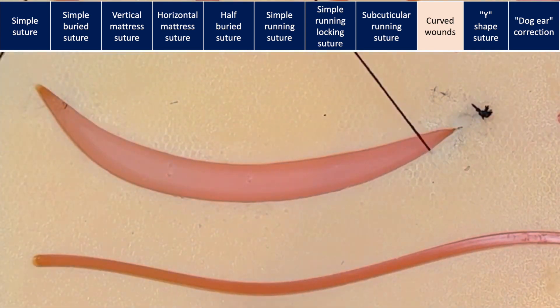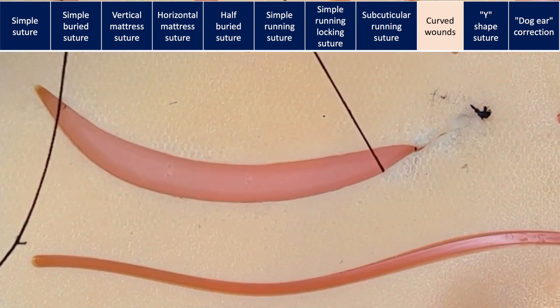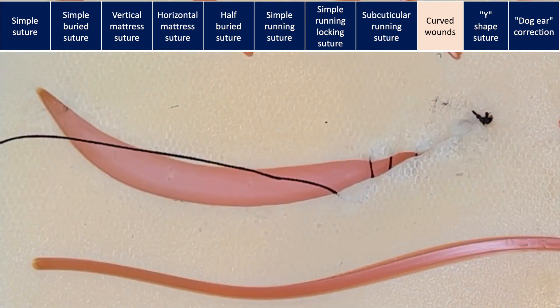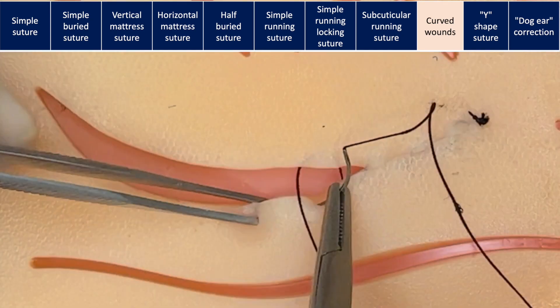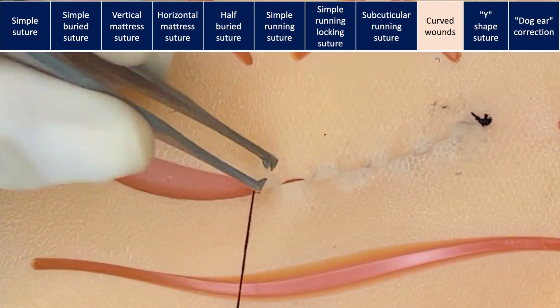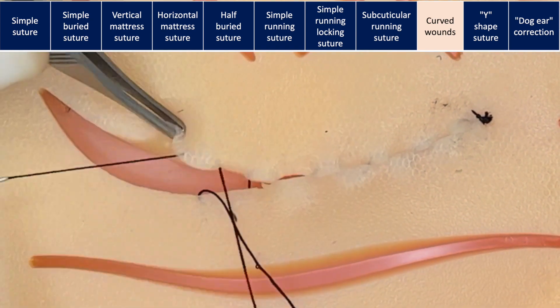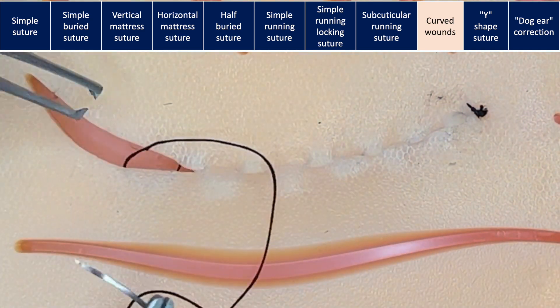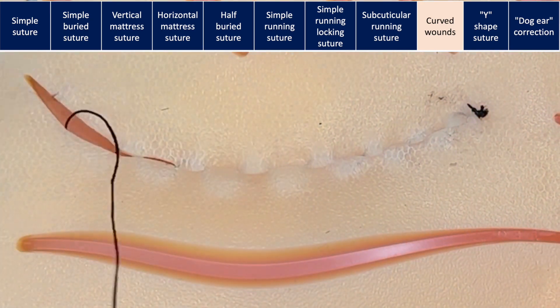In this case, we will close it using a subcuticular running suture. To start, we will take larger bites of skin at the edge of the longer-length wound and smaller bites in the shorter-length wound. You should also check where the suture is coming out — the needle may need to go slightly farther back along the front edge. This type of closure is applied, for example, in plastic surgery to close the areola when performing periareolar mastopexy, where we have a skin edge with a smaller inner circumference and a larger outer circumference.